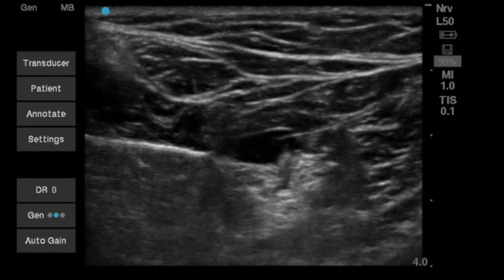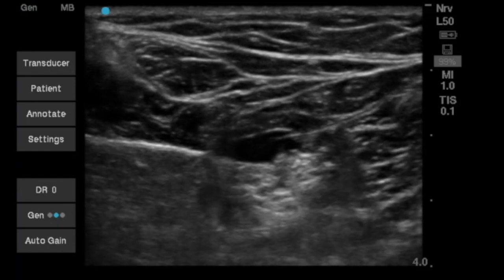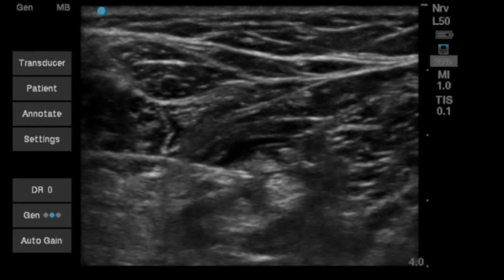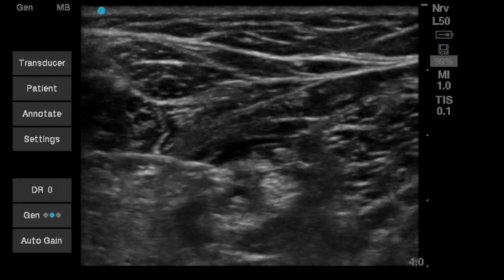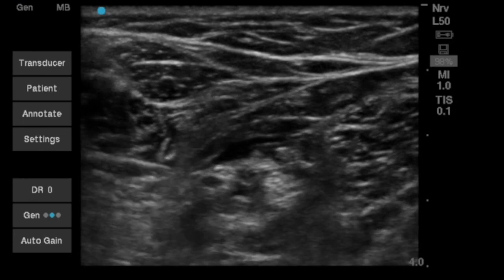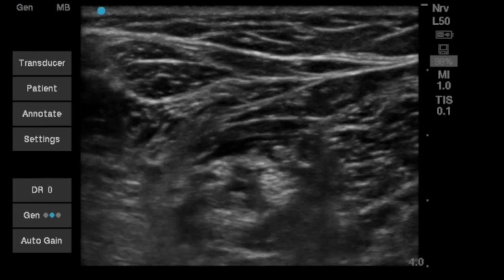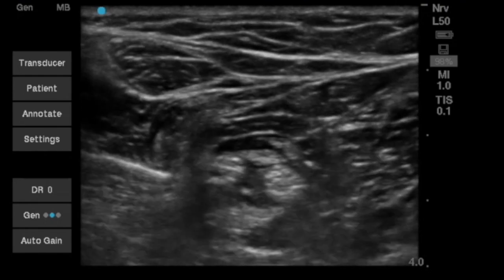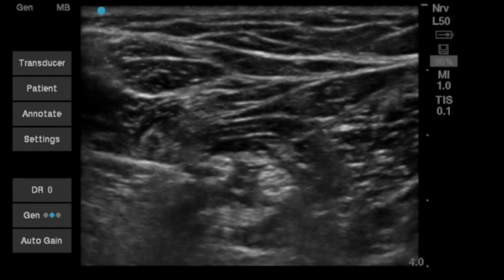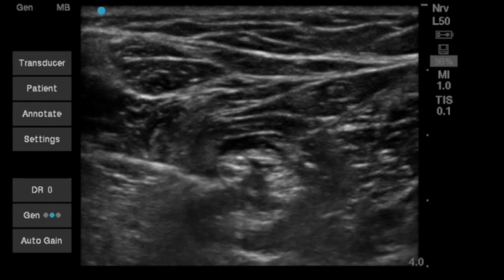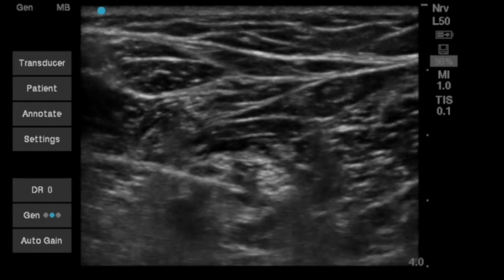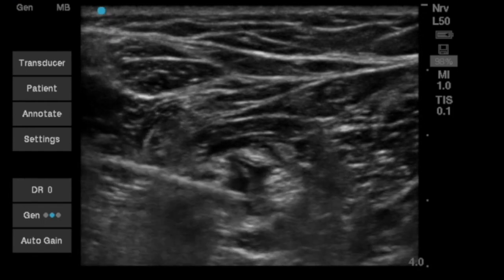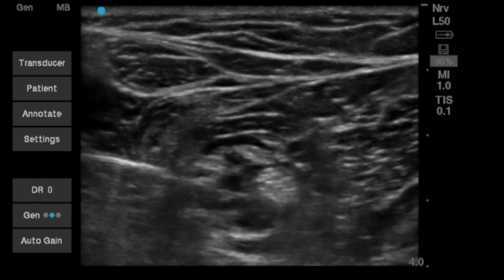This small paraneural sheath must be separated from the nerve for optimal blockade. The needle is then directed below the sciatic nerve, first passing under the common peroneal division and then directed upwards towards the tibial division, all while remaining in the paraneural sheath.